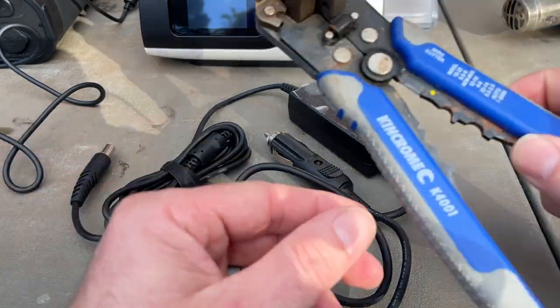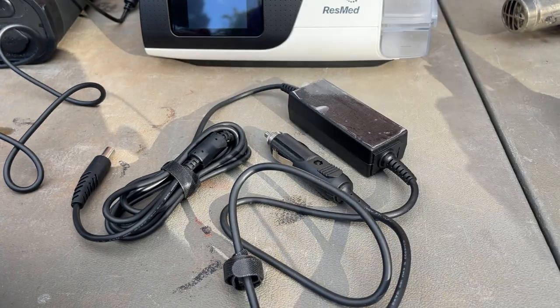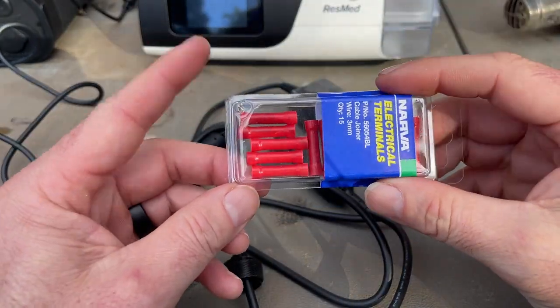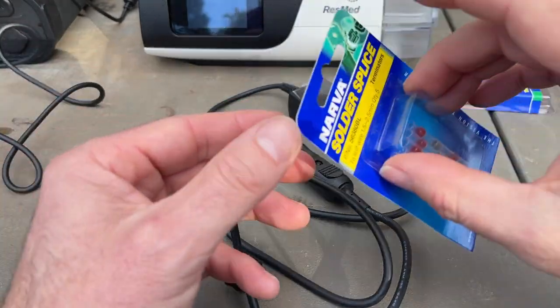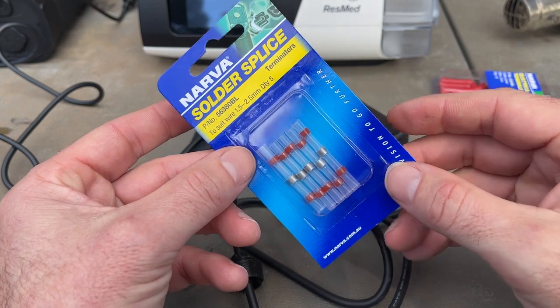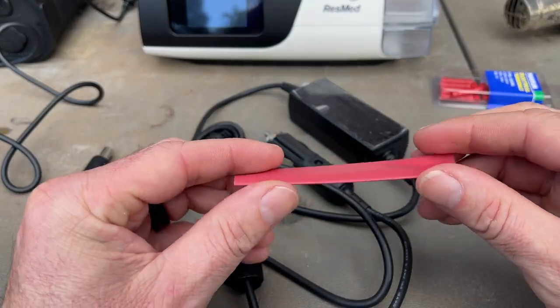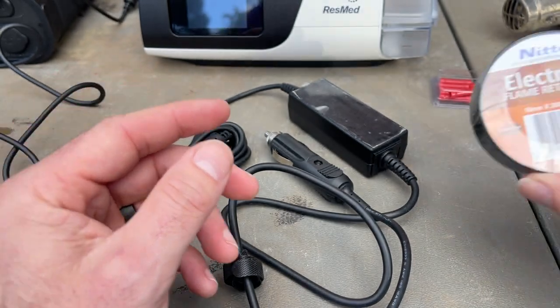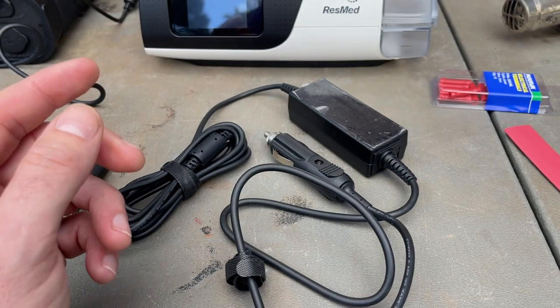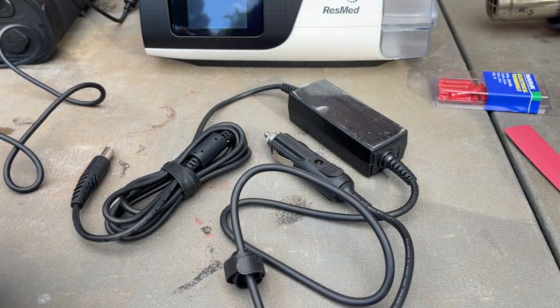What you will need is just some wire strippers because we'll strip back the wire. You could use just some standard butt connectors but I'm going to use these little solder splice ones which are pretty cool. We'll use the heat gun on them. I've got some heat shrink tubing. You could instead just use some good old-fashioned electrical tape, and I've also got my heat gun.